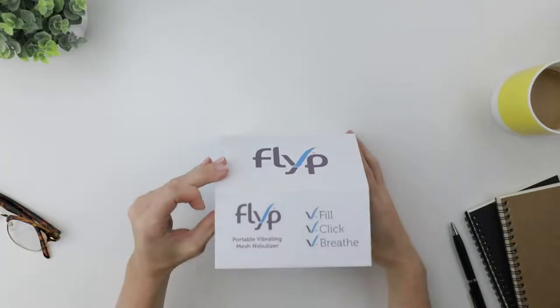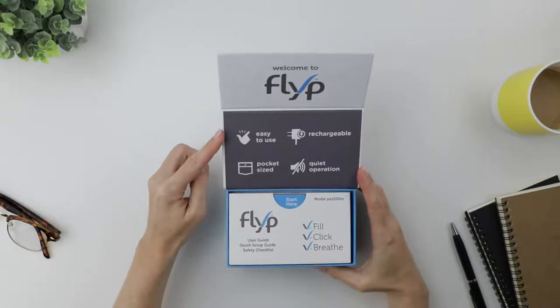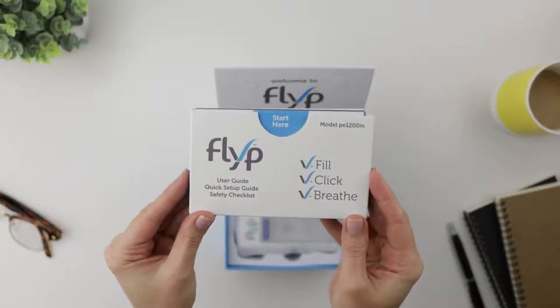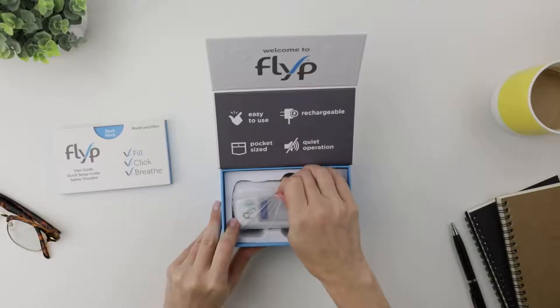Okay, let's open it up. We have some icons, the main product features: easy to use, pocket-sized, rechargeable, quiet operation. And here's a packet with everything I need to know to use it. We'll get back to that later — I really want to see this Flyp nebulizer first.